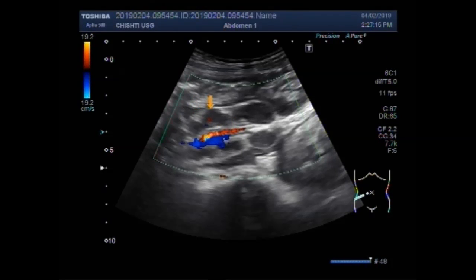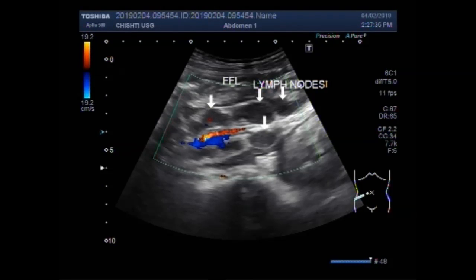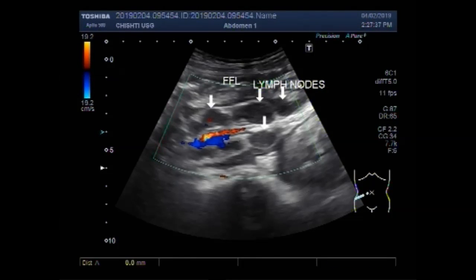You can see this and this one, this one also — these are the prominent lymph nodes. These are all prominent lymph nodes. The largest measures about 2.5 cm x 1.2 cm.